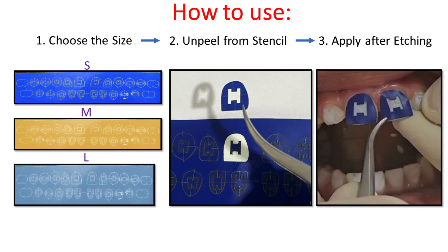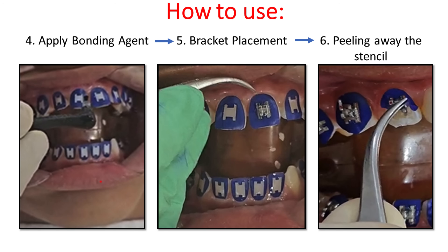Unpeel the stencil or sticker from the sheet and apply it on a dry etched tooth. The occlusal edge of the stencil should match the occlusal edge of the tooth. Apply primer to the cutout, bond the bracket, and cure. Remove the stencil after curing.